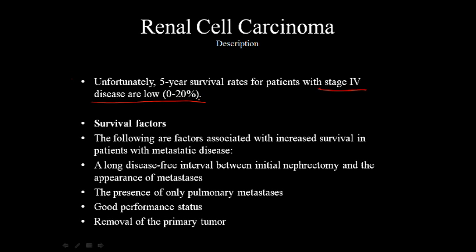And so one of us has to go out there and help hold him to the table, because once he actually came to, he was so disoriented that he was trying to fight everyone around. And so we get him on the table, and we do the scan, and we're reconning the scan through the head, and we're seeing all kinds of weird abnormalities, weird lesions through his head. There's one behind his eye, and there's about 4 or 5 more throughout his head.